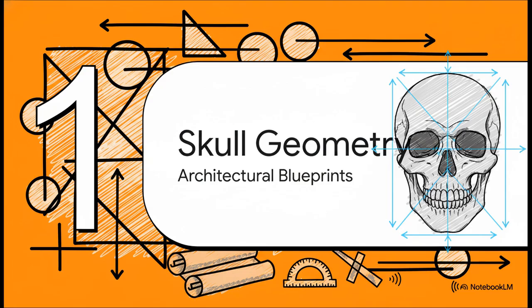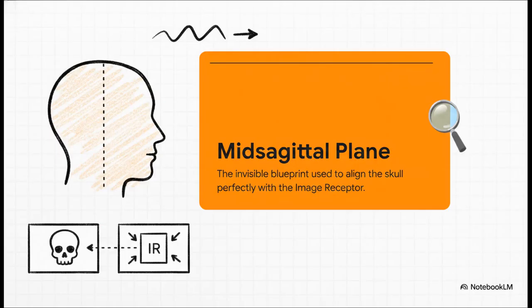Section 1. The geometry of the skull. To truly get these protocols, you kind of have to realize that radiographers are essentially acting as architects. They're constantly aligning specific anatomical planes of the human body with their equipment to reveal what's hidden under the skin. Now, the absolute most important term in this whole architectural blueprint is the mid-sagittal plane, or MSP. This is that primary invisible line that divides the body exactly in half, left to right.